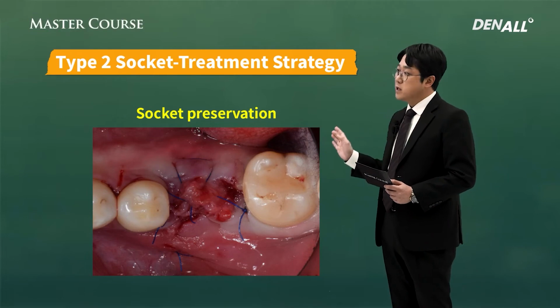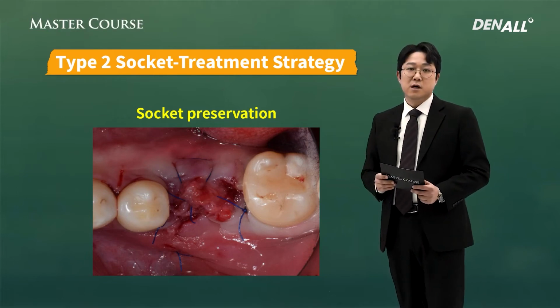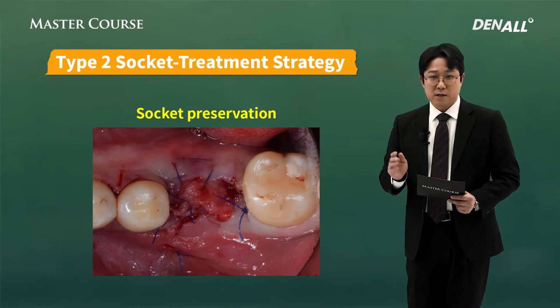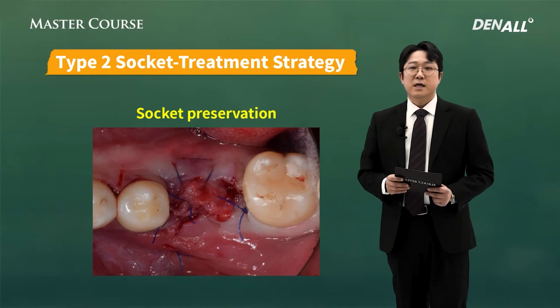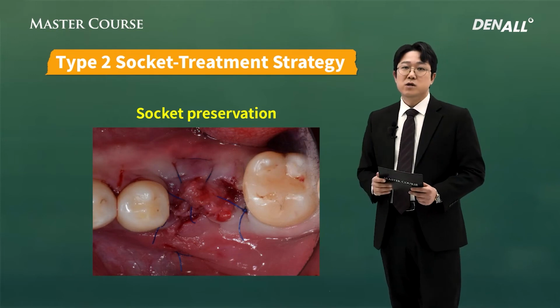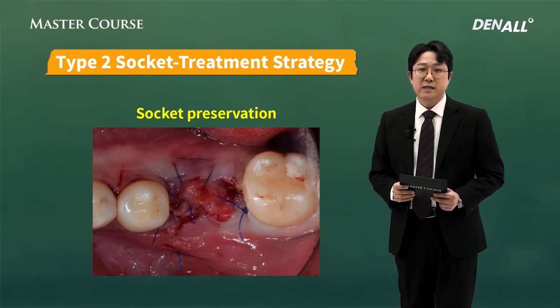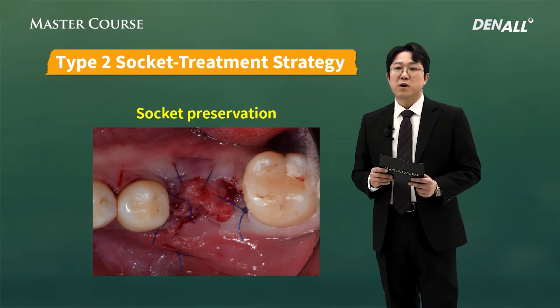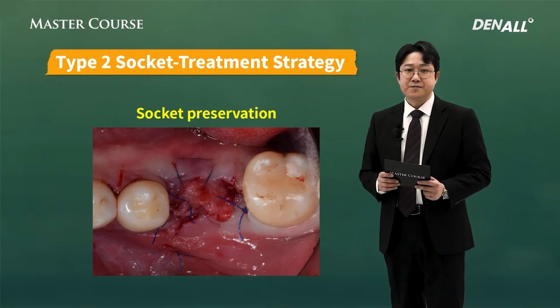I used non-resorbable membrane and used open membrane technique, or you can also use open healing technique where you use resorbable membrane. On the image, it looks like I got some primary closure, but the extraction socket, the soft tissue, I think it will open up.